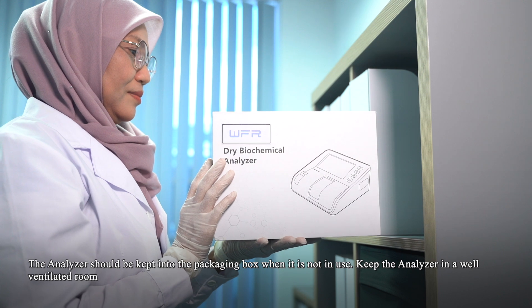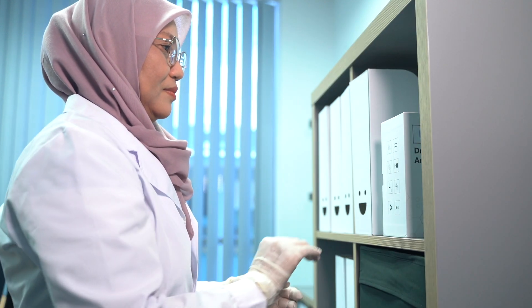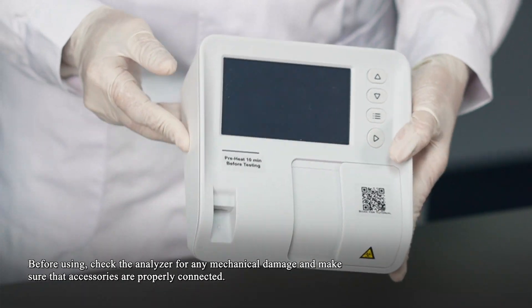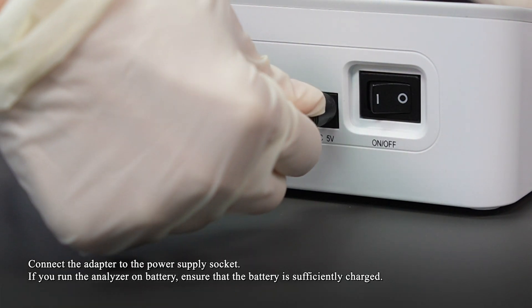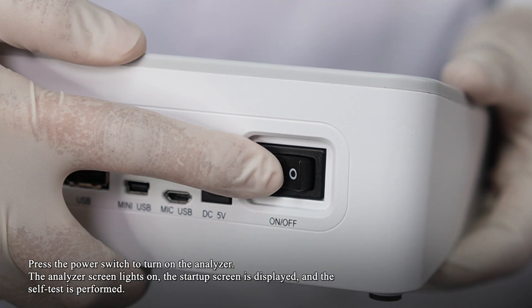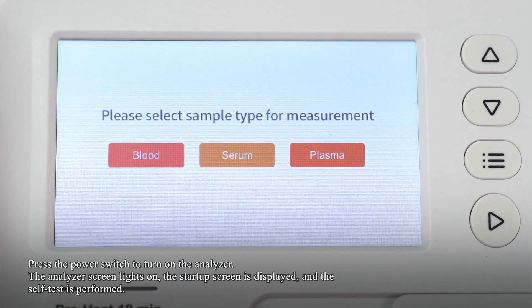The analyzer should be kept in the packaging box when not in use. Keep the analyzer in a well-ventilated room. Before using, check the analyzer for any mechanical damage and make sure that accessories are properly connected. Connect the adapter to the power supply socket. If running the analyzer on battery, ensure the battery is sufficiently charged. Press the power switch to turn on the analyzer. The analyzer screen lights on and the startup screen is displayed while the self-test is performed.